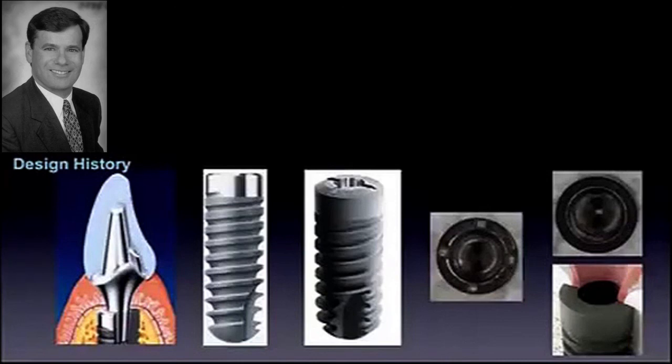We took every implant on the market and we placed them subcrestally for the purposes of getting emergence profile, in an aesthetic situation. We were in that trap with every implant that way. There are times you had to place it subcrestally. Well, when people started placing this subcrestally, they found that they had really good outcomes, even though it had a polished neck and a polished platform.